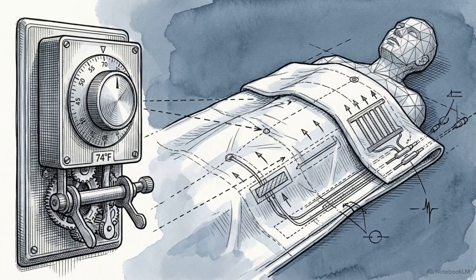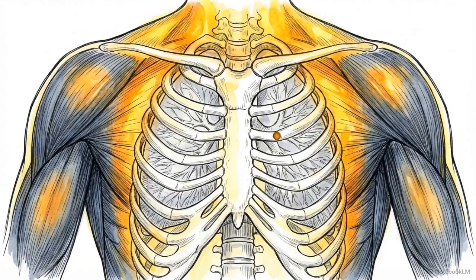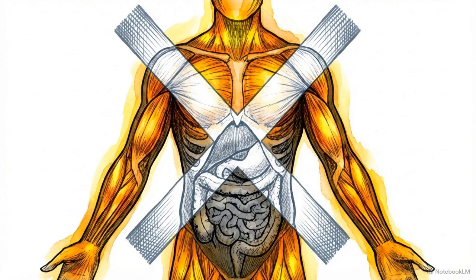Mitigating this requires environmental and pharmacological control. Technicians keep the room warm, place the patient on a high-fat, very low-carb prep diet, or administer adrenergic blockers like propranolol to suppress the sympathetic response. Without strict control over the patient's environment and chemistry, their systemic metabolic drive overwrites the tumor signal. The oncology scan degrades into a simple map of thermal regulation and anxiety.